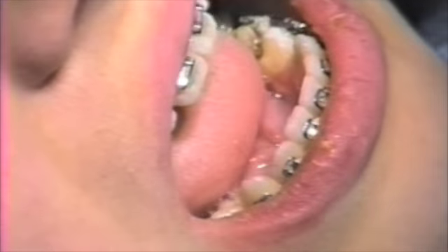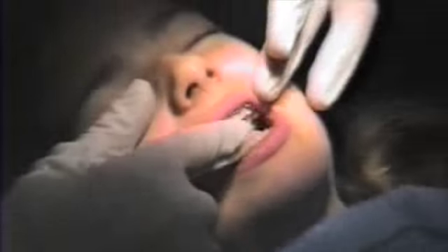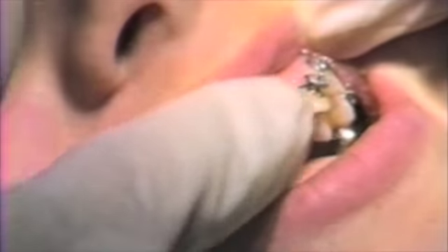After the tie-in is completed, be sure to check the distal ends before starting the next arch. The proper use of the distal end cutter is to grab the wire, slide forward until the cutter stops at the distal end of the tube, and squeeze. The end of the wire should be held with the cutter. Always confirm by checking for the cut piece since significant damage is possible when swallowed. Next, be sure to check with your fingers for any sharp spots that may cause irritation to the patient during the month.